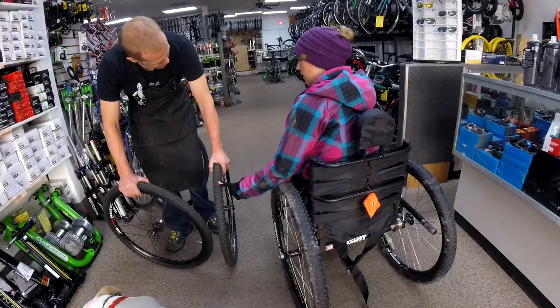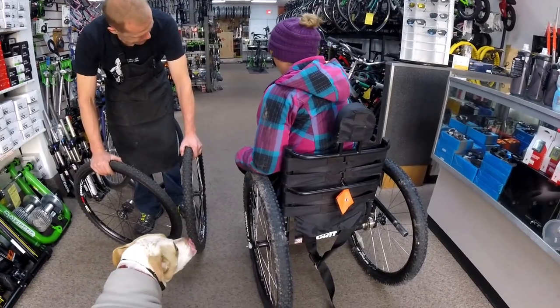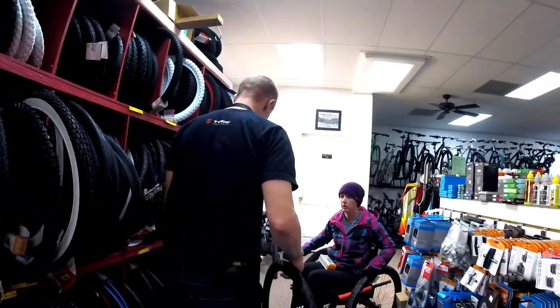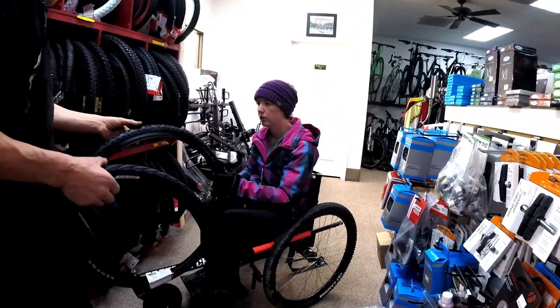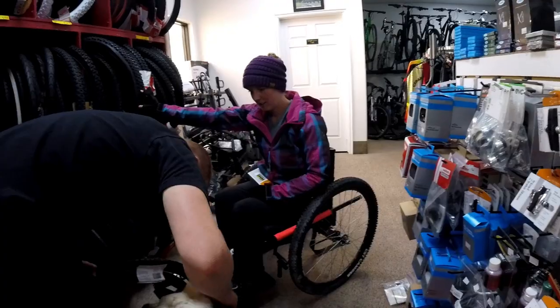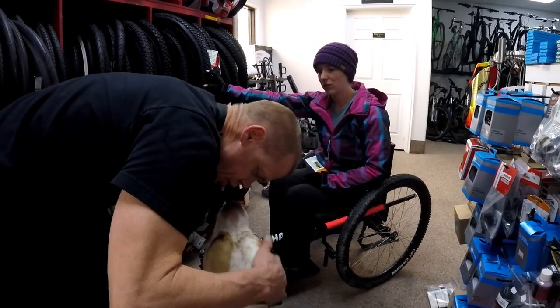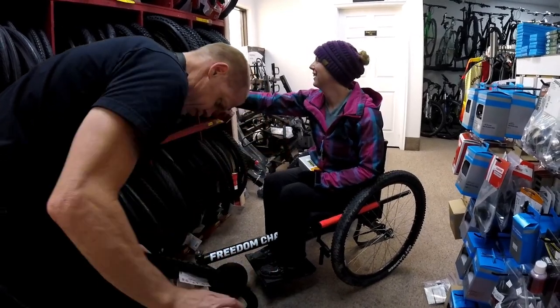After that was taken care of, I wanted to look at some new tires. I have an extra set of wheels and I wanted to replace the standard tire that came on my Freedom Chair with a smoother tread for when I'm just going around town or on paved trails. Brian was great about listening to what I wanted and offering different options. He was even able to set me up with a wheel bag to make storing and transporting my extra set of wheels even easier.